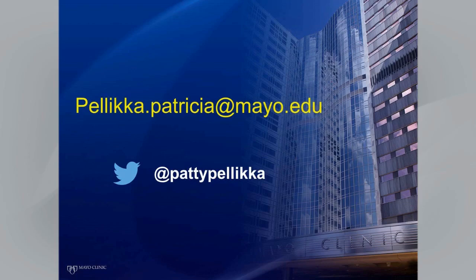There's a thought on the use of atropine with bicycle stress echo or dobutamine stress echo and how it might affect results. I think the role of atropine is best demonstrated in patients undergoing dobutamine stress testing for ischemia. There it clearly has been shown to increase the sensitivity of the test, particularly in patients who are on beta blocker therapy. I think its role with supine bicycle stress echo is less certain.